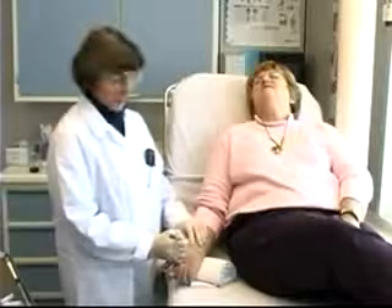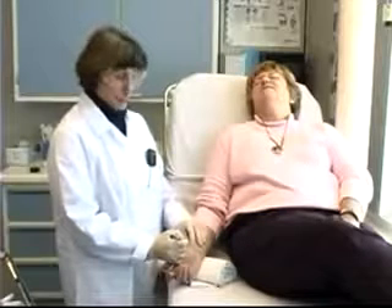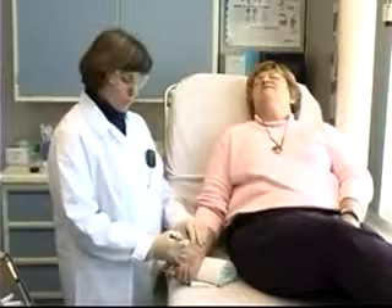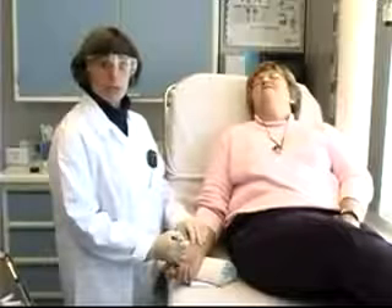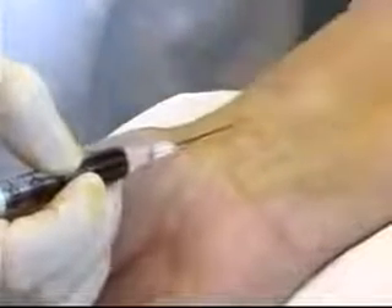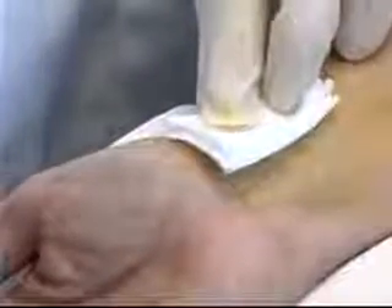Once I've put the needle through the skin, I next watch for a flash of blood into the hub of the needle, which tells me I've accessed the artery. I can then watch for the blood to pulsate back into the syringe. An adequate amount of blood in the syringe would be one and a half to two cc's. Once I've obtained that adequate sample, I'll cover the area with my 2x2 gauze and very quickly pull the needle out of the skin.